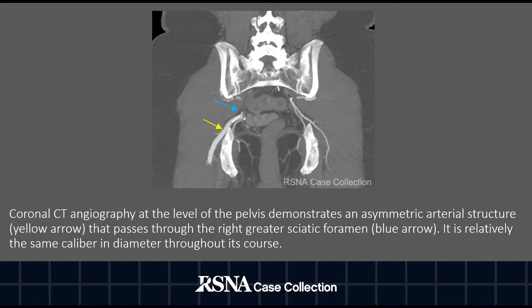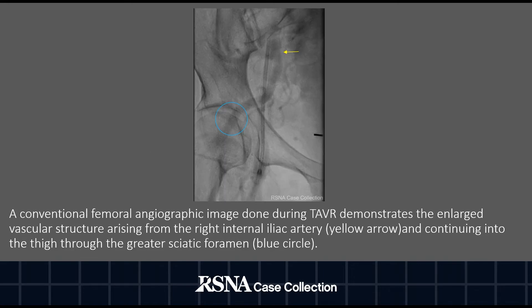A conventional femoral angiographic image done during TAVR demonstrates the enlarged vascular structure arising from the right internal iliac artery, highlighted with the yellow arrow. It continues into the thigh through the greater sciatic foramen, which has been highlighted with the blue circle.